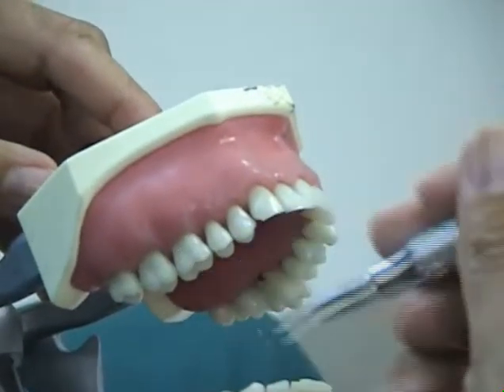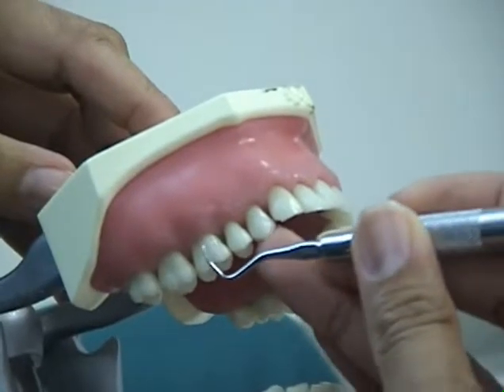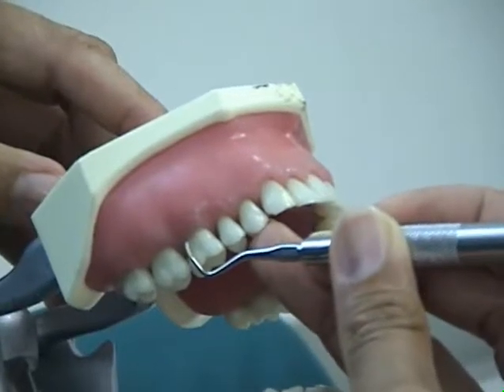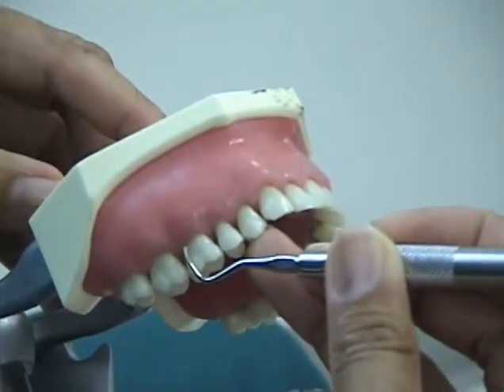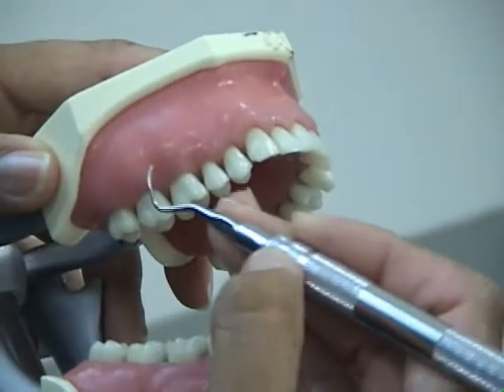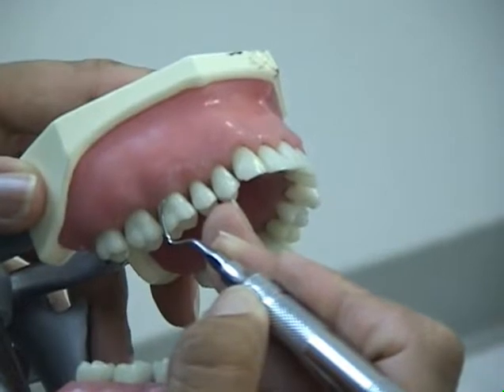Adaptation of the curette is placing the first one or two millimeters — the lower third of the side of the toe — in contact with the tooth. This is correct adaptation. If the middle third of the working end is in contact with the tooth, this is incorrect.